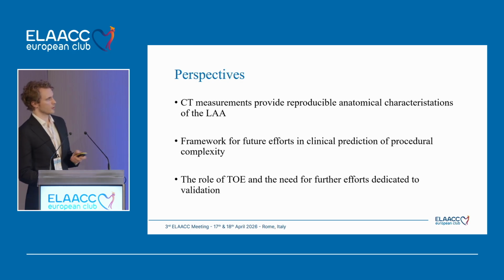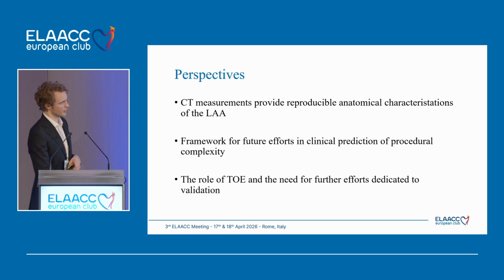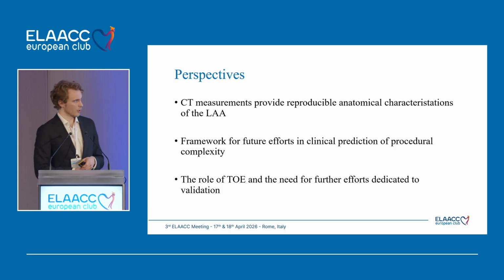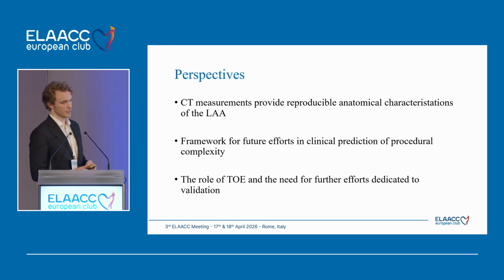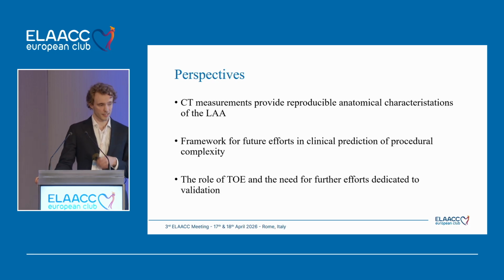And as the purpose of this study was centered around CT measurements, we have not done an analysis as to how our CT measurements correlate with TOE. And this is an obvious next step, and TOE also faces other aspects, such as interobserver reproducibility, which would need to be addressed in coming studies. But with the great role of TOE in many centers in the field, efforts to extend the validation study to this modality are important next steps.